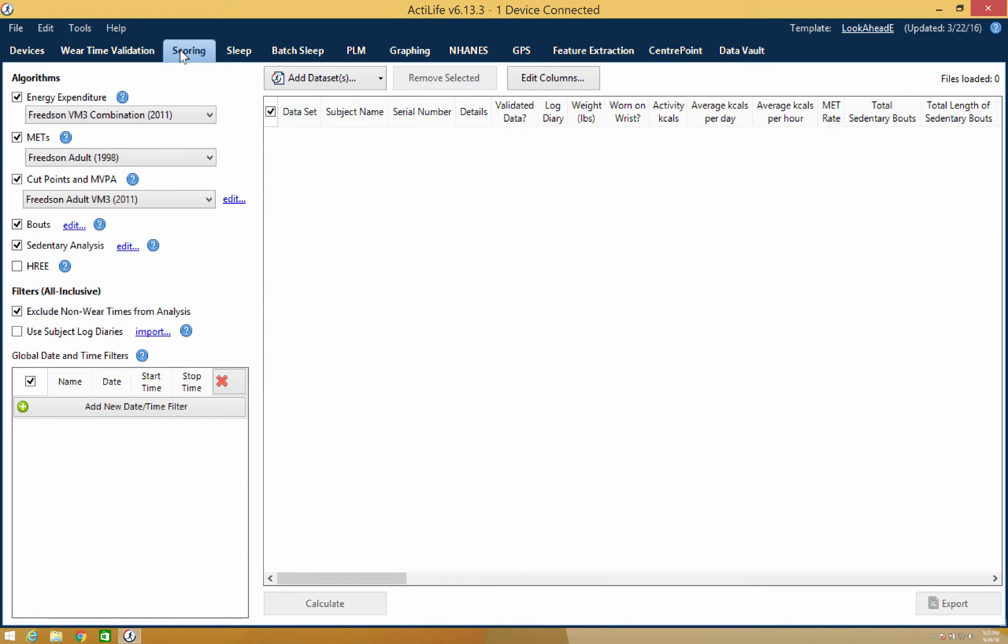Scoring is the location you go to score the daily physical activity of your subjects.